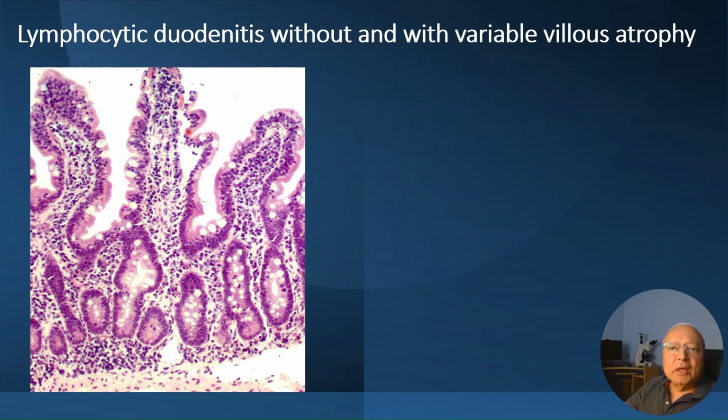This, on the other hand, is lymphocytic duodenitis, and it has some slightly shortened villi. And here you have an increase in intraepithelial lymphocytes. This is a very busy looking surface, and in the surface, there are these small lymphocytes embedded within the epithelium, and they are greater than 30 per 100 enterocytes. Also notice that the cellularity in the lamina propria is elevated as well, and there is also some crypt proliferative activity. There is some mitotic activity in the crypts, showing regenerating crypts.